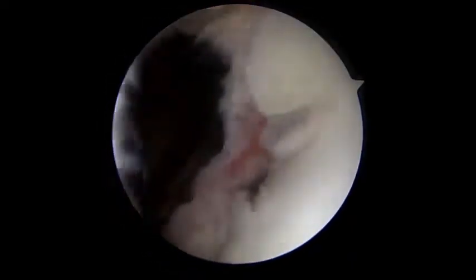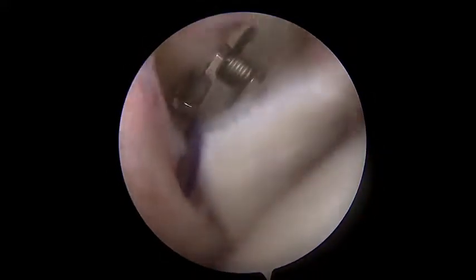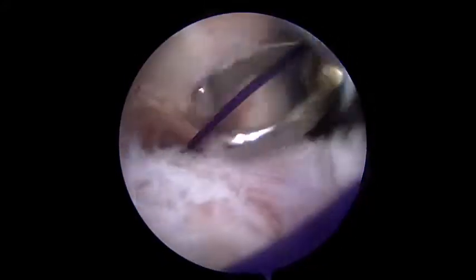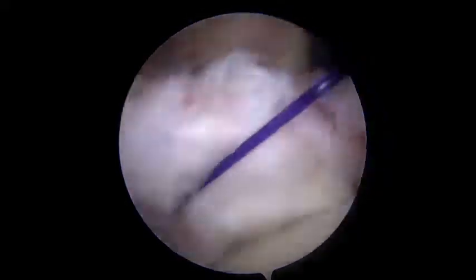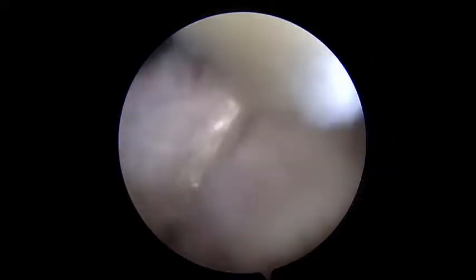An accessory anterosupralateral portal is established 2 centimeters anterolateral to the angle of the acromion. An 8-millimeter cannula is positioned within this anterosupralateral portal. A self-retrieving suture passer is utilized to place 0 PDS suture to the inferior lateral aspect of the subscapularis tendon. It is positioned at the junction of the superior 2/3 and inferior 1/3.